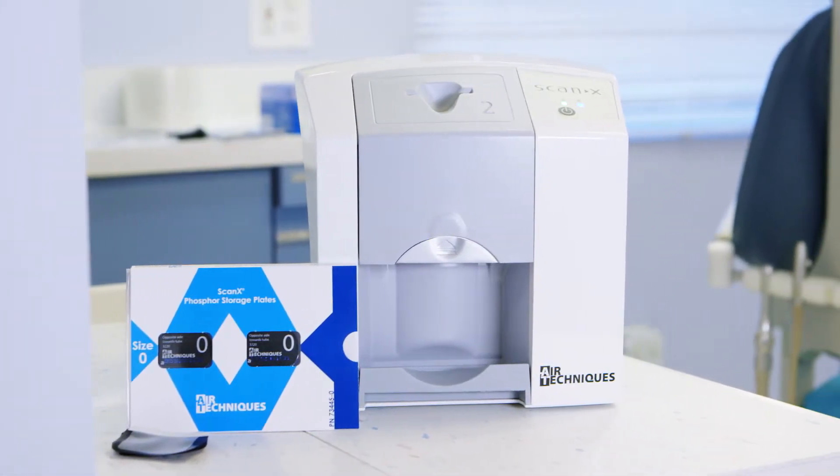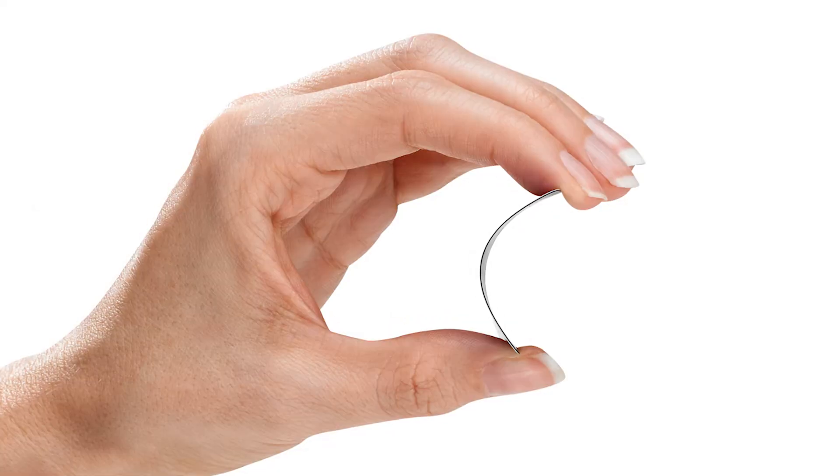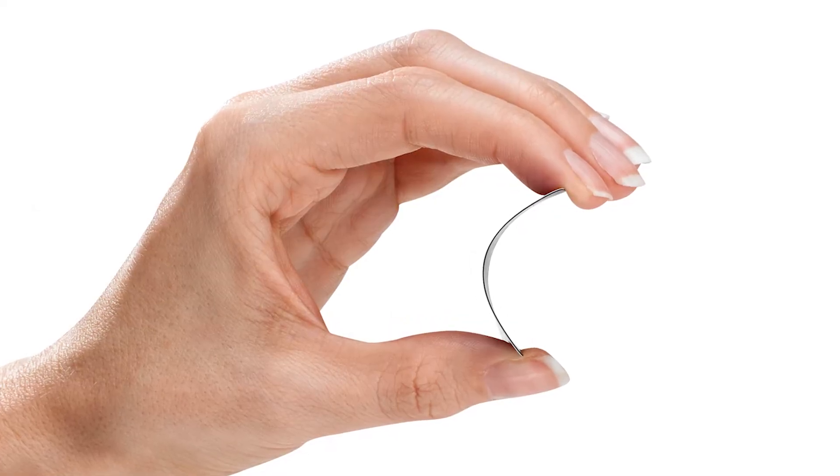It's compatible with chair-side intra-oral imaging, and it fits in any operatory. It accepts size 0, 1, and 2 of the cordless flexible phosphor sensor.